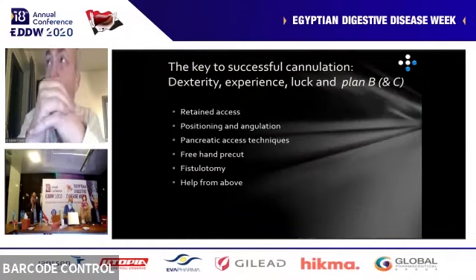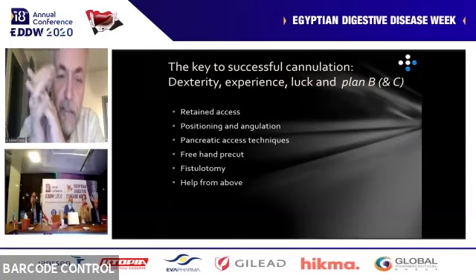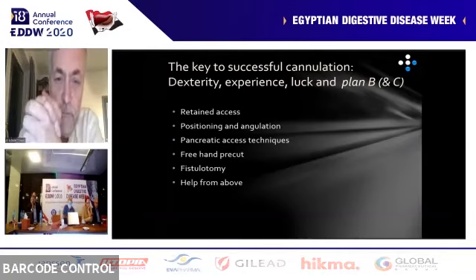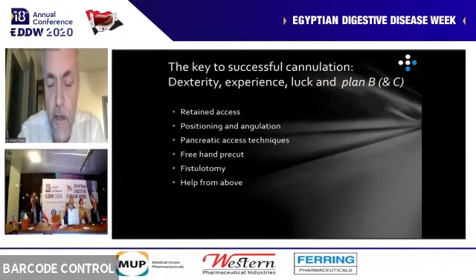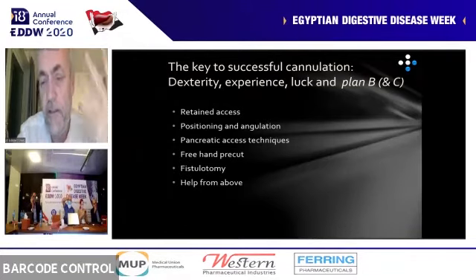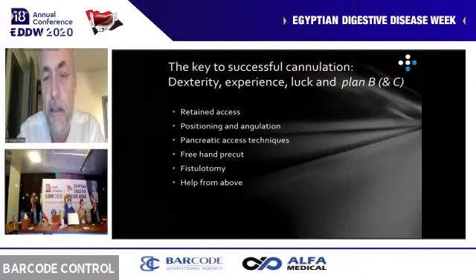And then to successfully cannulate, I think you need dexterity, you need experience, but you also need to think ahead that if your primary plan doesn't work, then you should already in your mind have a plan B and C and D to know what to do if your initial idea doesn't work.